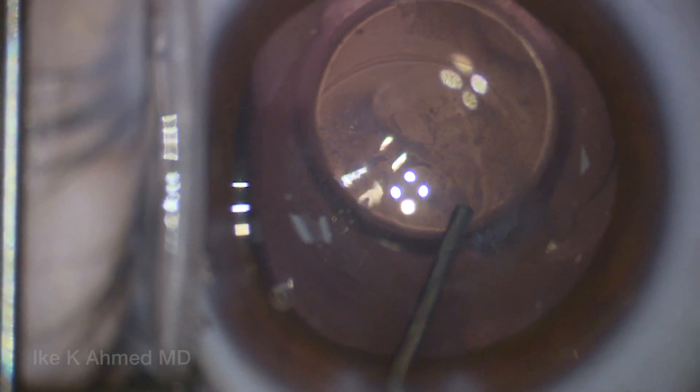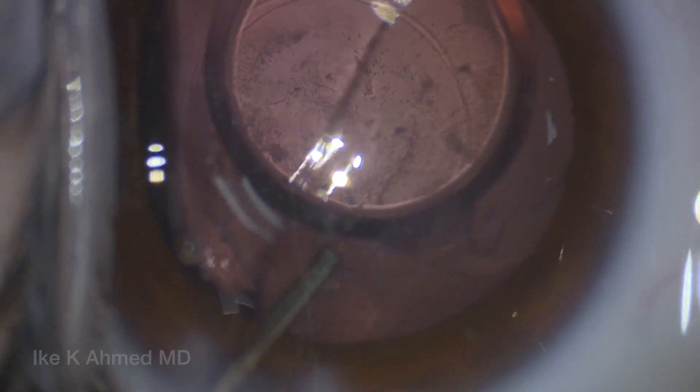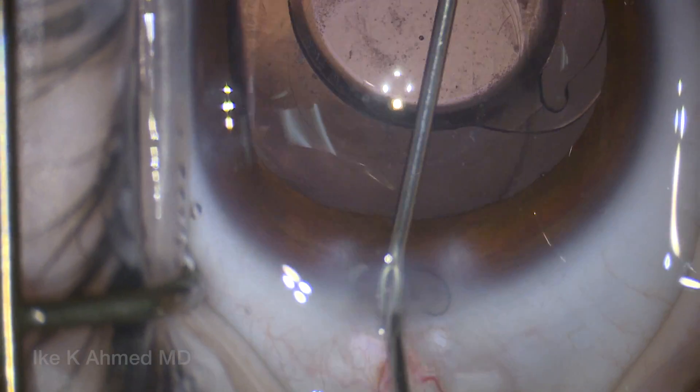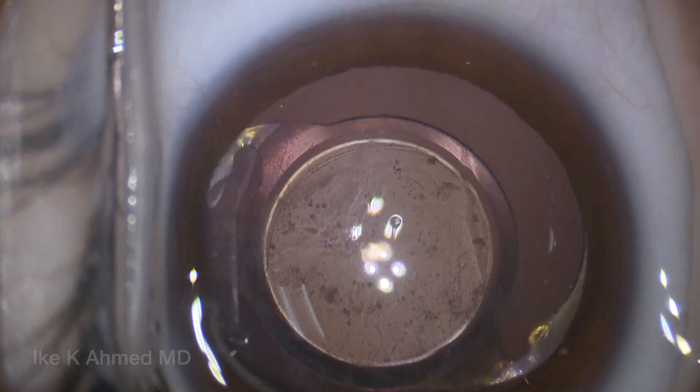Very carefully, you can see I'm literally tugging on the anterior hyaloid without actually disrupting it and without pulling excessively due to concern for vitreous traction. We continue to vacuum with intermittent injections of viscoelastic. We're able to maintain the anterior hyaloid face and very carefully vacuum some of those bits on the anterior hyaloid. This is a very interesting opacity — not a classic posterior polar opacity.